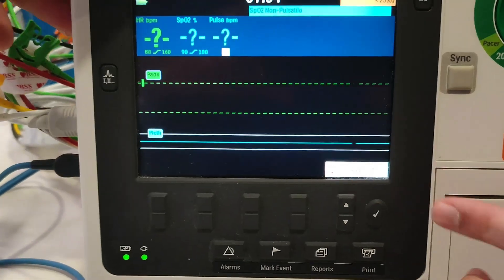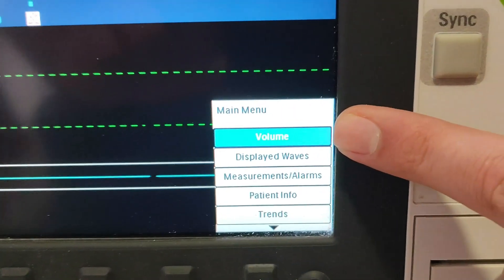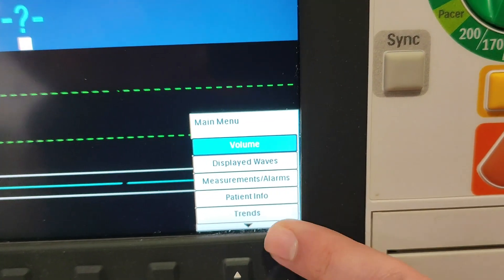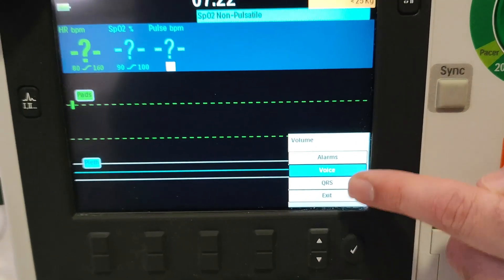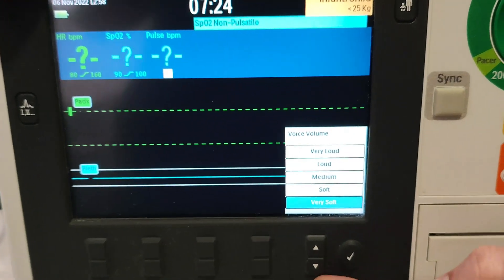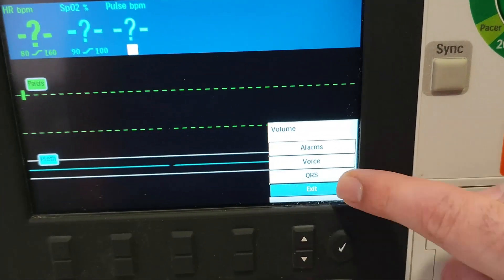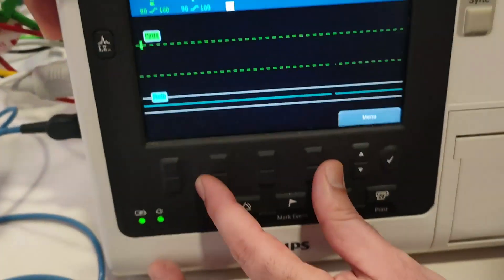From here you can go to the menu. You can adjust the volume, display the wave setting, set measurements and alarms, as well as enter patient information or view the trend. For the volume setting, you can change the voice — select soft or the desired level, then press exit.